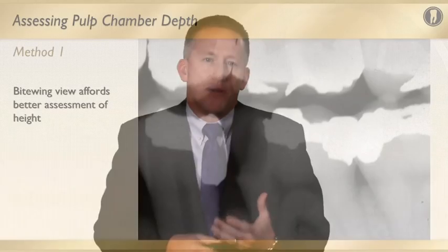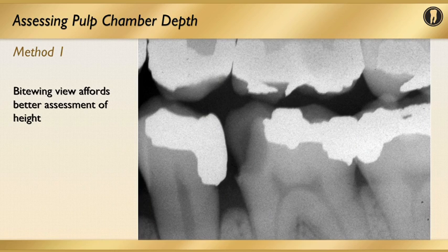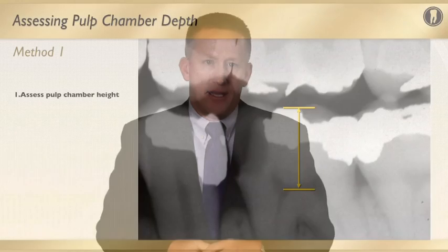Instead, we should consider bitewing radiographs. Bitewing radiographs by nature are taken at a more direct, more parallel aspect so that measurements can be more accurate and more determinate of the anatomical realities within the tooth. If we look at two methods of pre-preparation techniques in determining the depth and aspects of posterior canal preparation, it will help lead to more successful, less invasive, and adequate preparations in your posterior access for endodontic therapy.